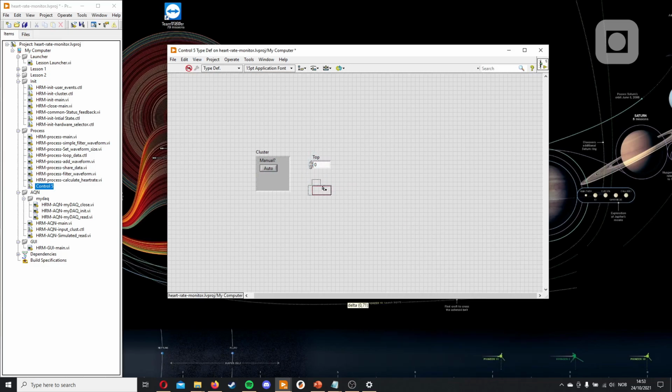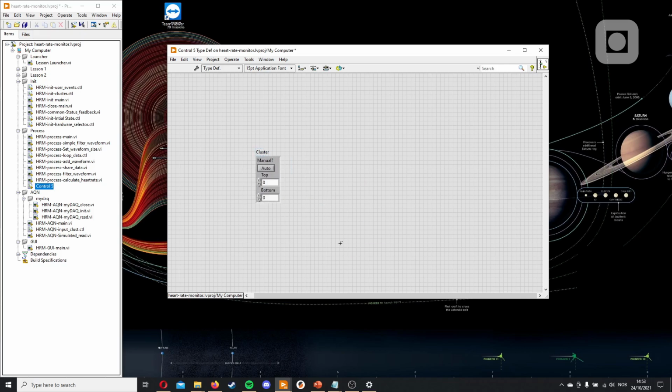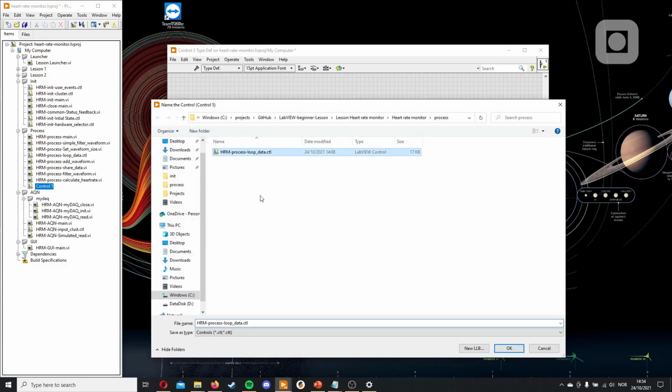Our function will work by us setting the top and bottom value, where the top is where everything over means a peak has happened, everything below means that that's reset. This is to create a sort of hysteresis of our pulse. I'll go more into detail of how it functions later. We'll just call this pulse settings. Maybe I'll add something here later. And we'll use that same name for saving.